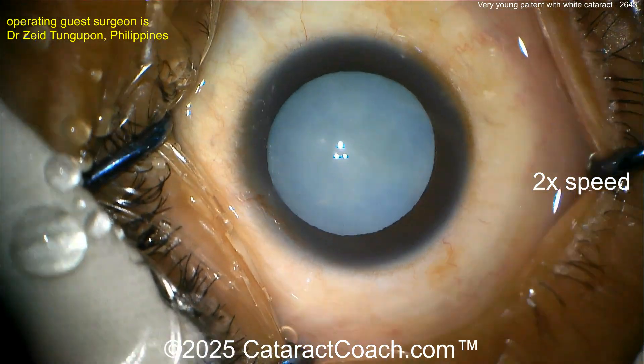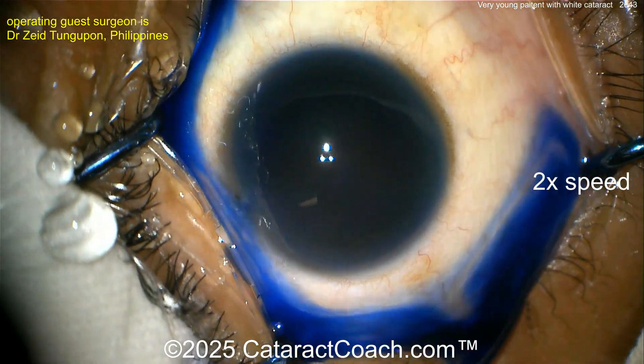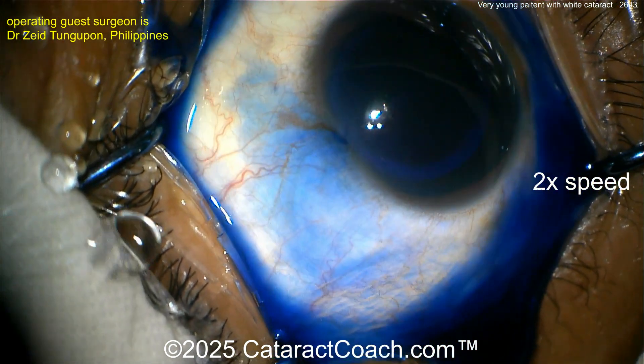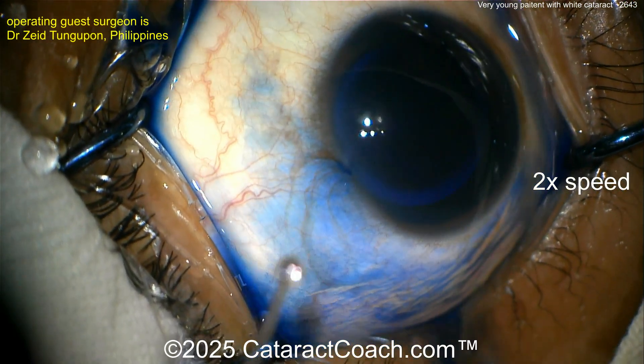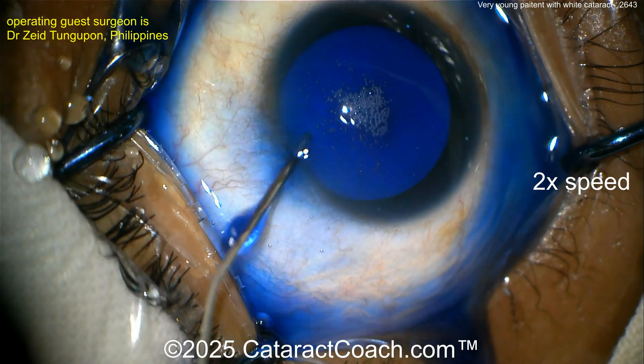Because there's no nucleosclerosis. I can tell you here — look at those eyelashes — very young patient. So a little bit of trypan blue dye going inside the eye here, and then we'll wash that out, and now the capsule looks really blue obviously, but you can tell there's no nucleosclerosis because there's no yellowness at all.